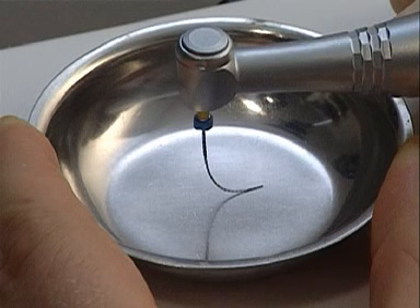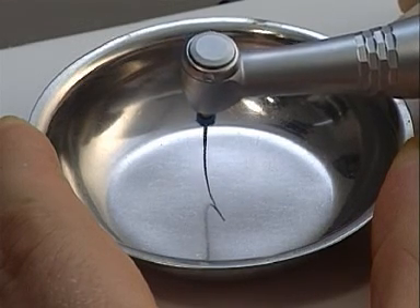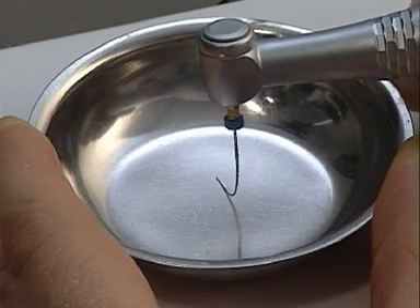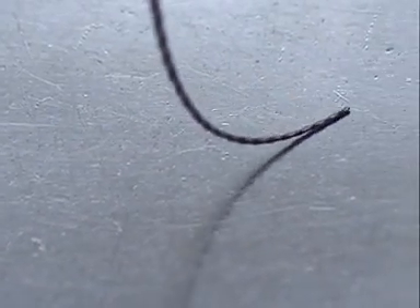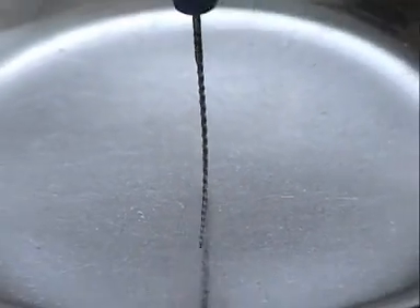Nickel-titanium is highly flexible and, due to its so-called memory effect, nickel-titanium files do not deform but return to their original shape once the load has been removed. Should they be subjected to excess torsional stress or suffer material fatigue through being used too many times, they will break without warning.